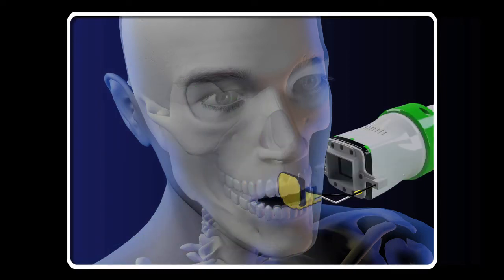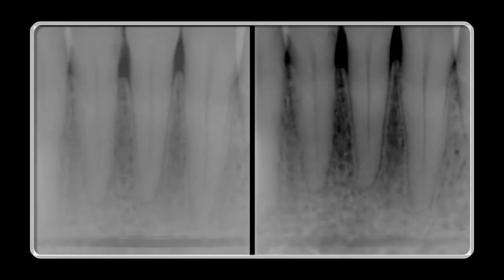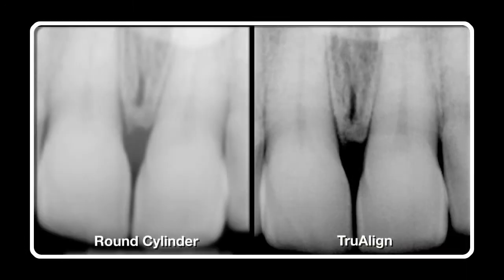TruAlign acts like the scope on a rifle. The beam is only 2% larger than the receptor. By drastically reducing scatter radiation and collimating the beam, the images regardless of machine or receptor type are clearer and crisper and contain greater information as shown here in this side-by-side comparison. This translates into improved patient care and increased practice revenue.